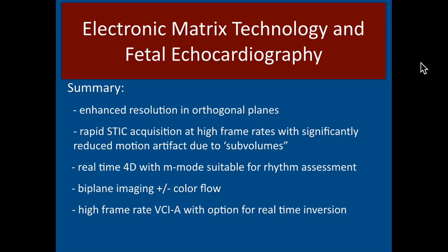So summary, just to go over some of the salient features of electronic matrix technology, you can see it's everything that I've discussed here. I know it's in your syllabus, so I won't bore you any further, but I really appreciate your time. Thank you.